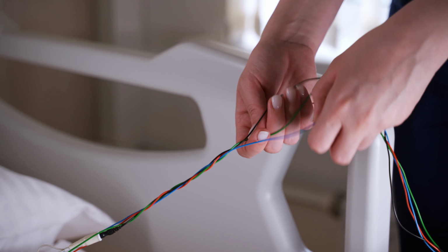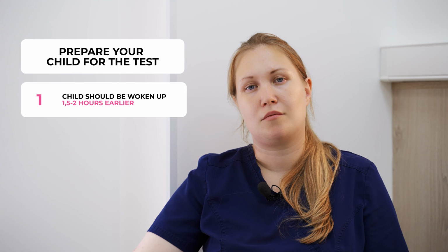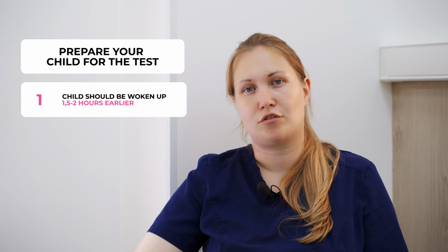Parents should be told that the child must be prepared for the examination. Usually, the child should be woken up on the day of the examination, 2 hours earlier than the usual time of rising. The examination should preferably be carried out during the usual daytime sleep. Take with you a bottle, a blanket, a pillow, or anything, especially the ones the baby likes to sleep with.